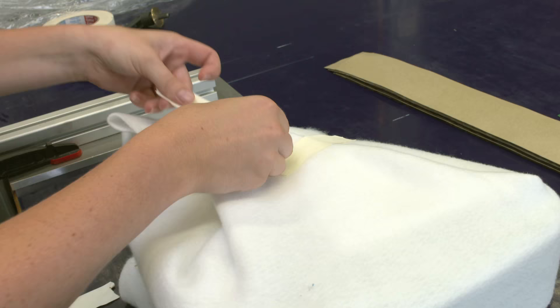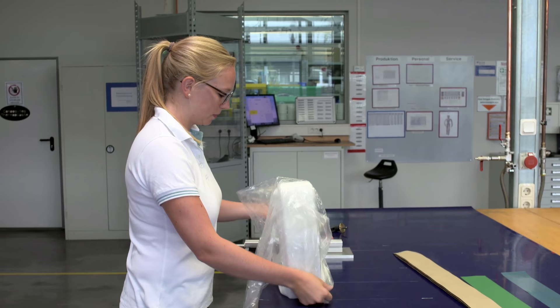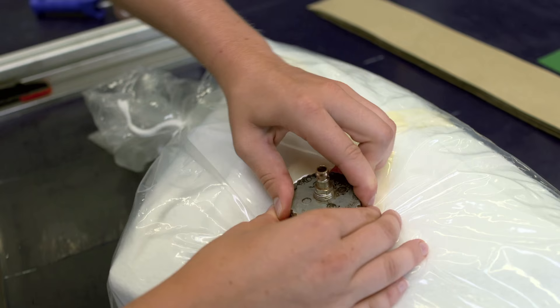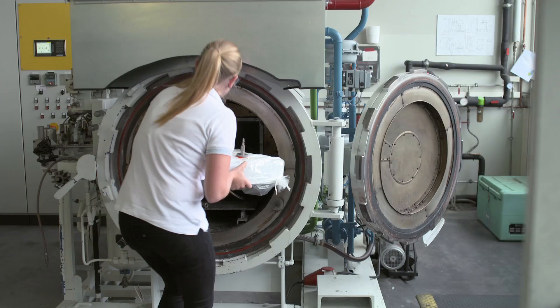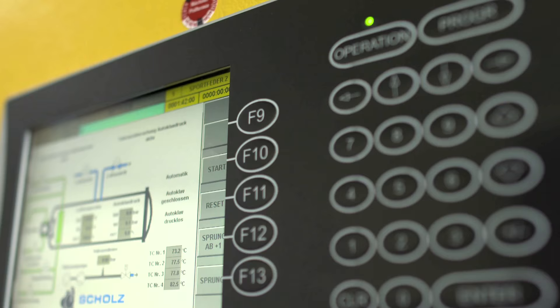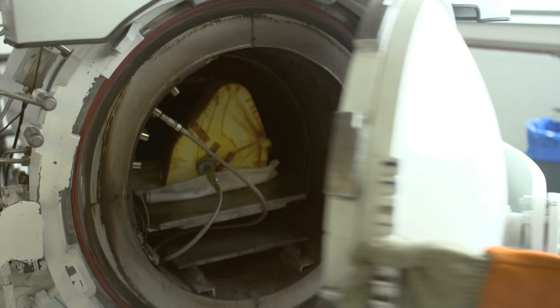After the layering process, we put the mold in the vacuum bag because we have to suck the air out from between the layers to prepare it for the curing process. The mold is then put in an autoclave — like an oven — at above 150 degrees, where the curing process chemically hardens the resin.